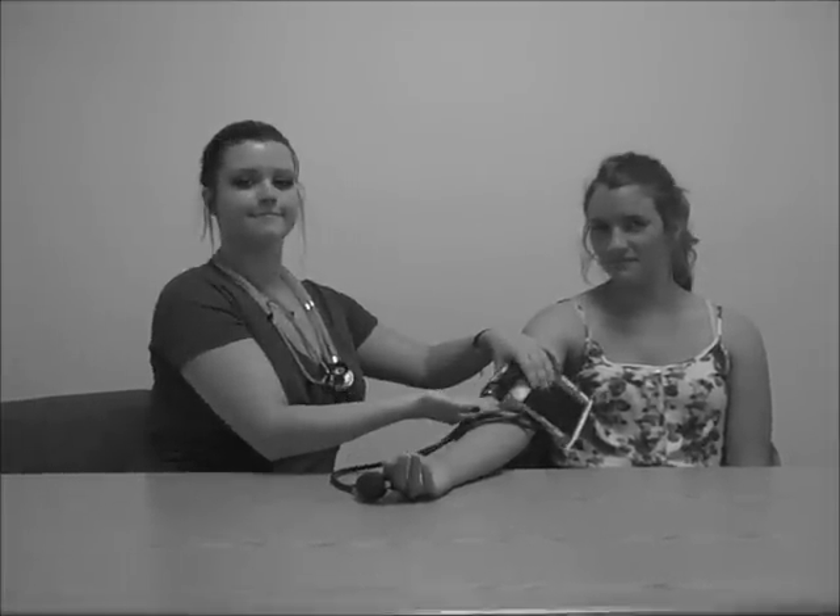Place the blood pressure cuff snugly around the patient's arm, lining up the index arrow with the brachial artery, making sure that the pressure release valve is in a closed position.